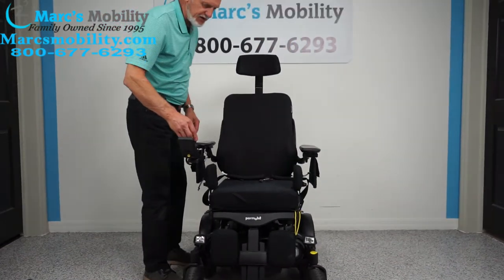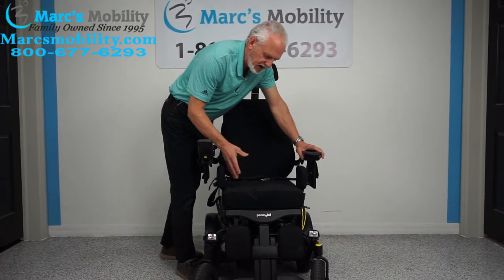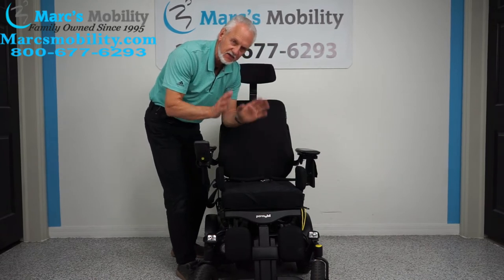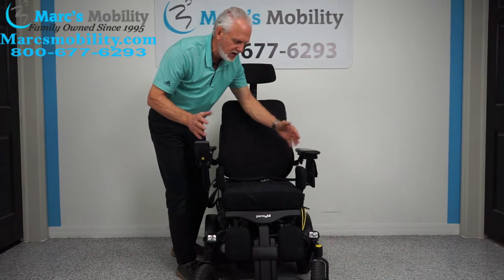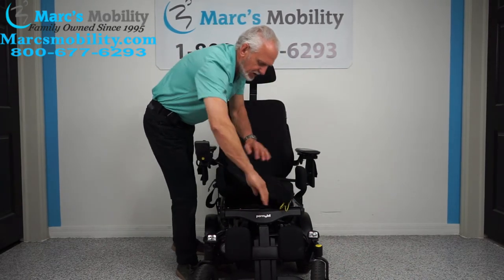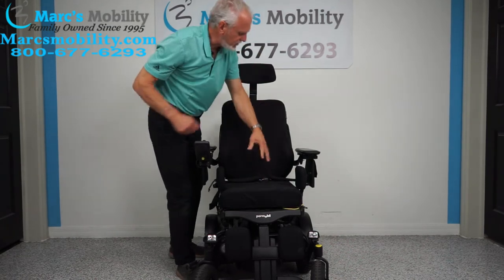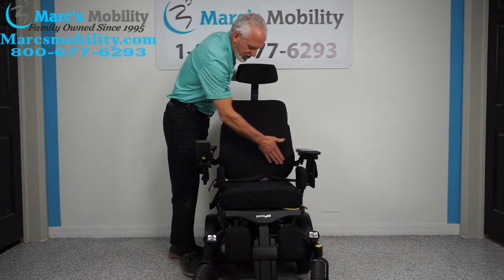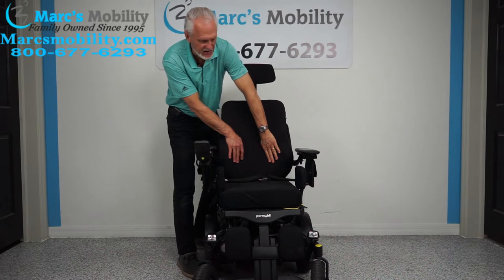The seat on this chair is a Roho air cushion, 16 by 18. But these chairs can be customized to your size — if you need an 18, 20, or 21-inch cushion, we can put a bigger one. We can make the frame larger, change the cushion, or change the back. This one has a really nice wing back that keeps you centered in the seat.